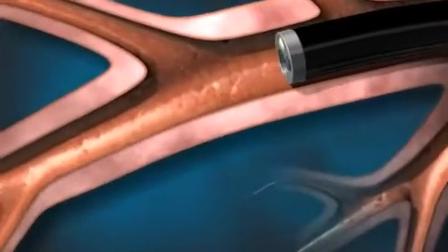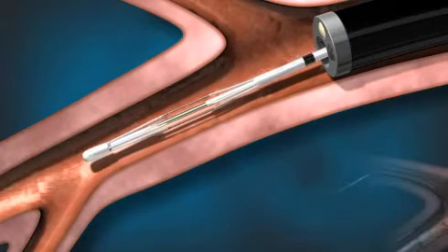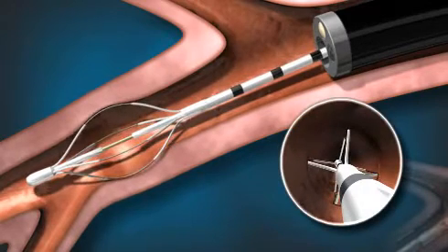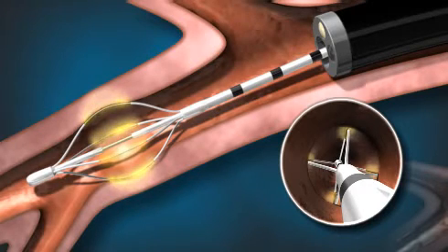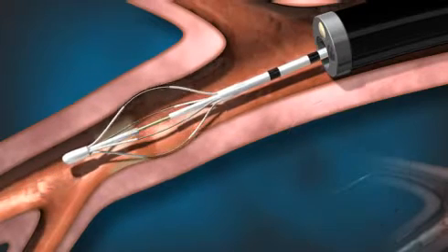The Allaire device has an expandable wire electrode array at the tip. When it is expanded, the arms of the electrode array come in contact with and fit snugly against the airway wall. The expanded electrode array then delivers controlled radiofrequency energy for about 10 seconds to heat the airway smooth muscle.